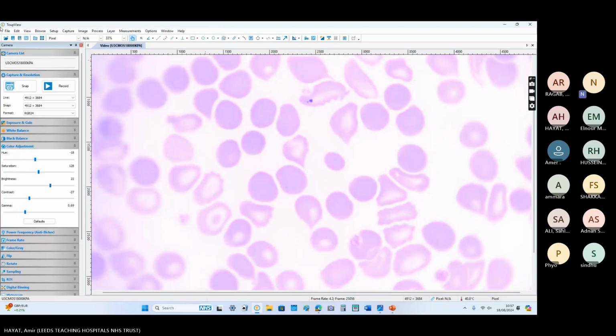I cannot say whether it's a sickle cell trait or sickle cell disease or hemoglobin C disease or just iron deficiency. So what would my conclusion be in reporting? That these findings are consistent with iron deficiency or hemoglobinopathy?